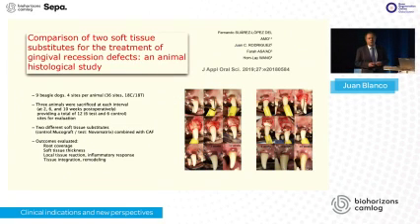And let me share with you one of the more recent published studies, where they compare matrices in an animal. In a preclinical study in vivo, they compared two different matrices in 9 beagle dogs. One is the Mucograft, used as a control, and the test is the novo matrix.